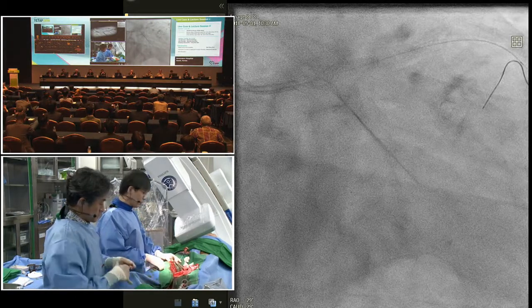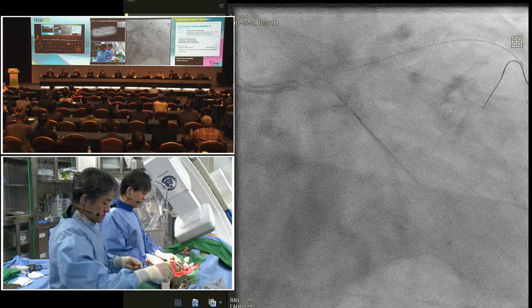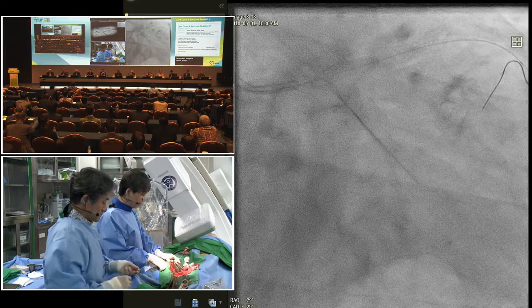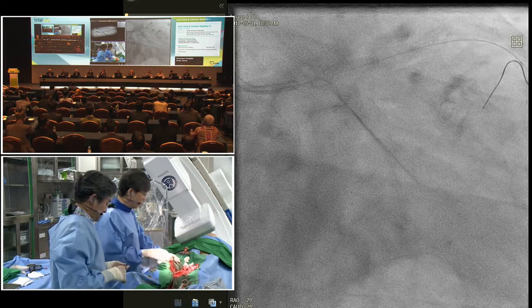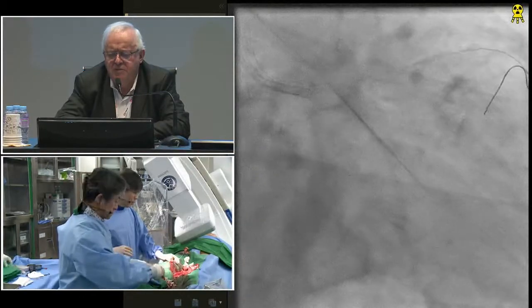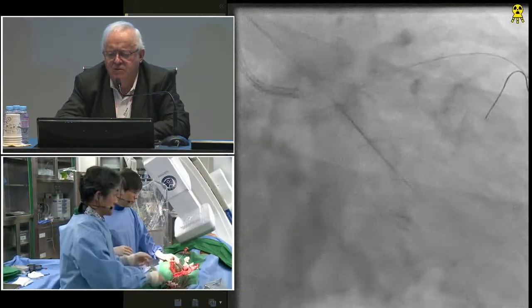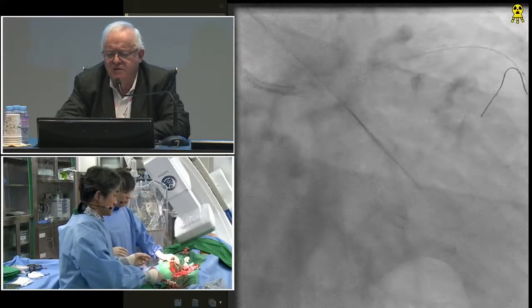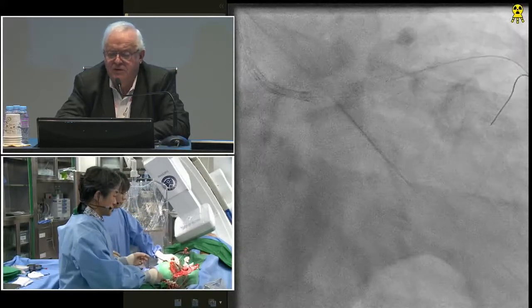First of all, I'd like to cannulate first, and then do IVUS, and then I will decide on a POT or not. Because I presume that at least in some part of the left main, this stent is not well apposed. So if you put your second wire now, there is a risk of crossing outside.